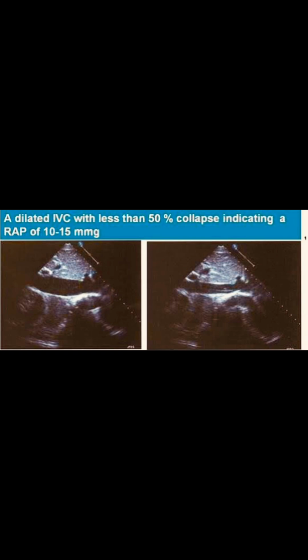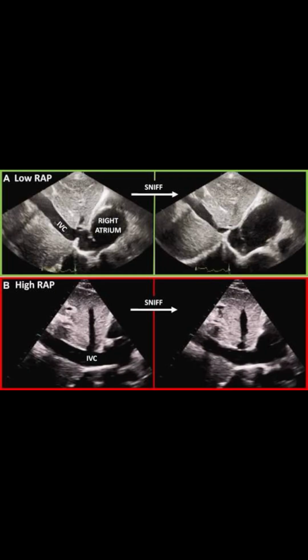Why it's important to assess the IVC with echo. There are several very important reasons to assess the IVC with echocardiography. A couple of the more important are to determine right atrial pressure or central venous pressure, determining the pulmonary artery pressure, as well as assessing fluid levels in the patient. By obtaining these few measurements, physicians are able to treat patients on the spot.